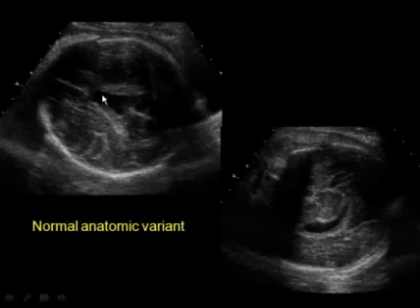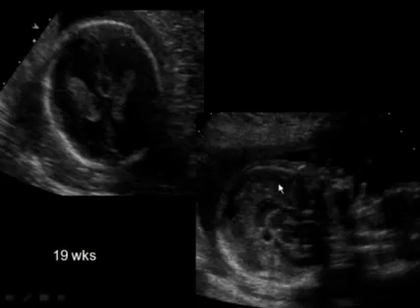The cavum vergae is a posterior extension of the cavum septum pellucidum. It's seen in the midline between the lateral ventricles, and it can be seen here underneath the corpus callosum on the sagittal view. When the cavum vergae extends posteriorly, it's termed the cavum velum interpositum, and here we see it earlier on in the midline at 19 weeks, and on the sagittal image at the posterior aspect of the corpus callosum, a little tiny cavum velum interpositum, a normal variant. It does not need to be even included in the ultrasound report.